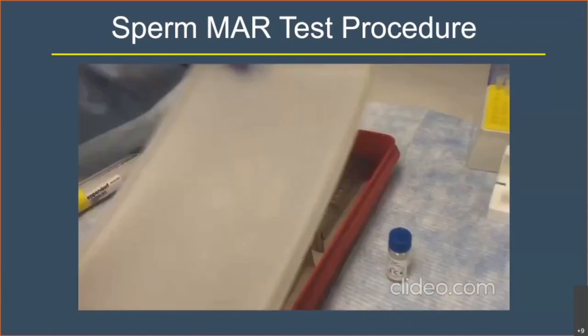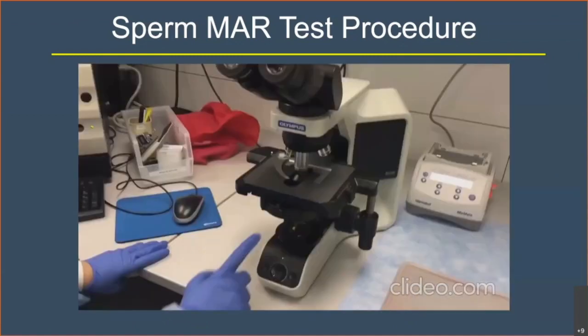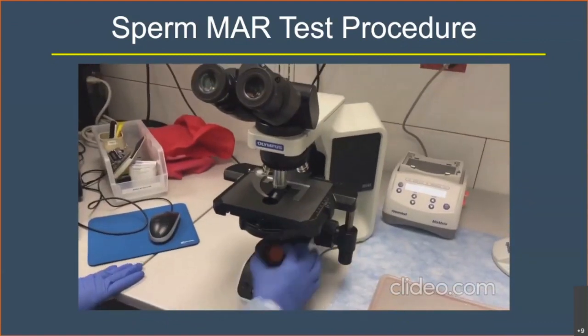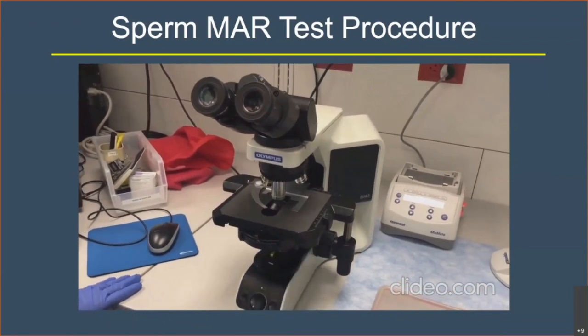And then a cover slip is placed on the slide. This slide is placed in the humidified chamber. We place a timer for 3 minutes. So once the incubation is done, the reaction has happened, then this slide will be examined on the phase contrast microscope. Next slide, please.